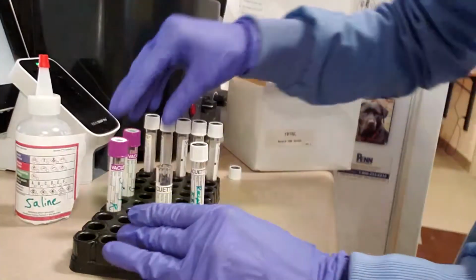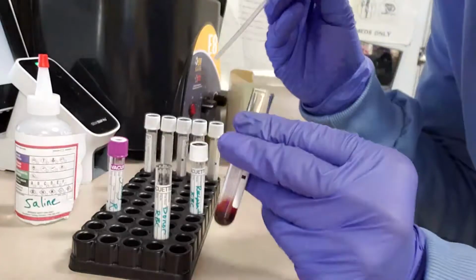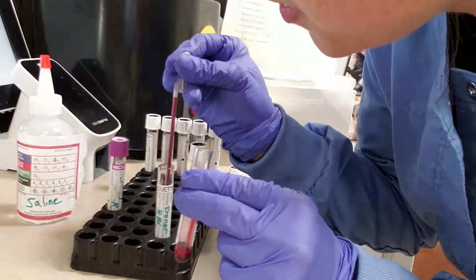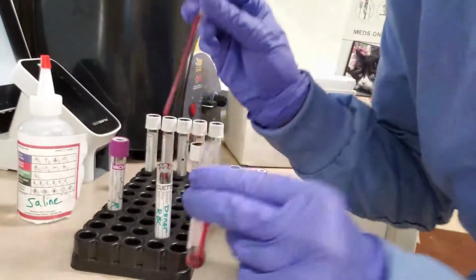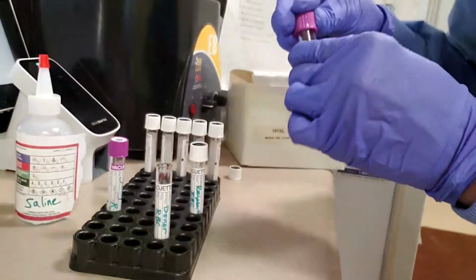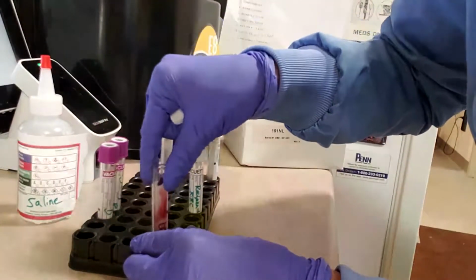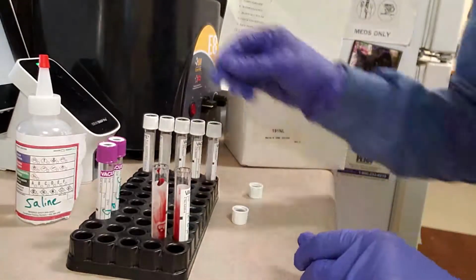So now it's time for our donor red blood cells. And again, we want to put them into our non-additive clear tube, transparent tube. Okay, discard that. Okay, so now we have our donor red blood cells, our recipient red blood cells. Put our caps here. So now we will start our wash.